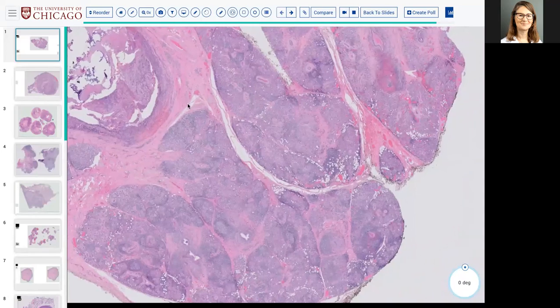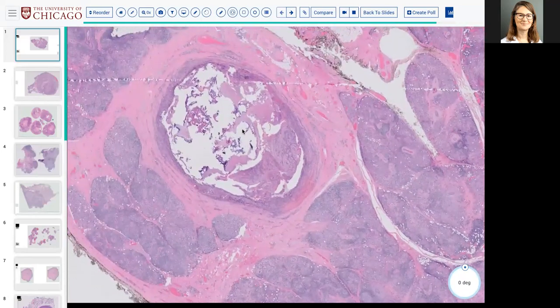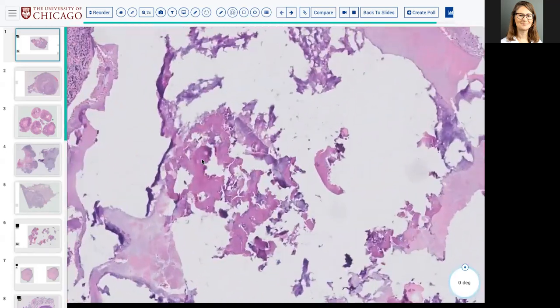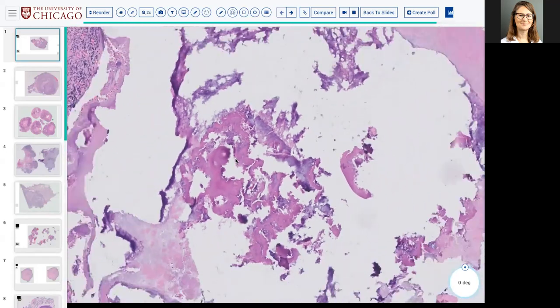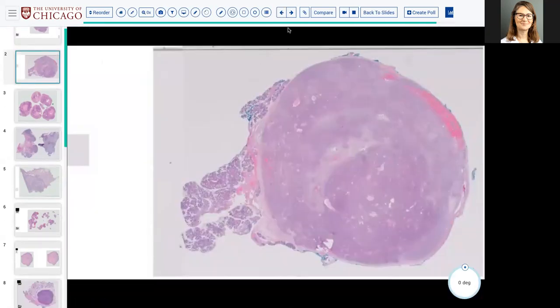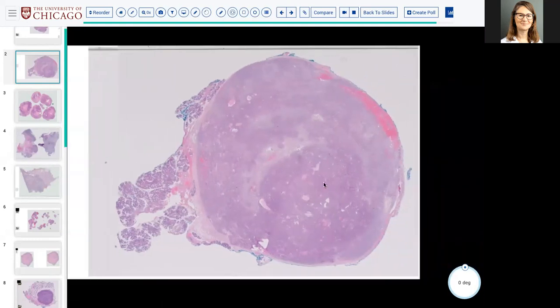So just a nice example to remember that this is a very common problem, but we don't necessarily always see it because it's more medically managed. And if we do see it, sometimes they're just these little gross only stones. Okay, that was hopefully not too challenging of a one. Okay, awesome. Yep, stones. So the next one.